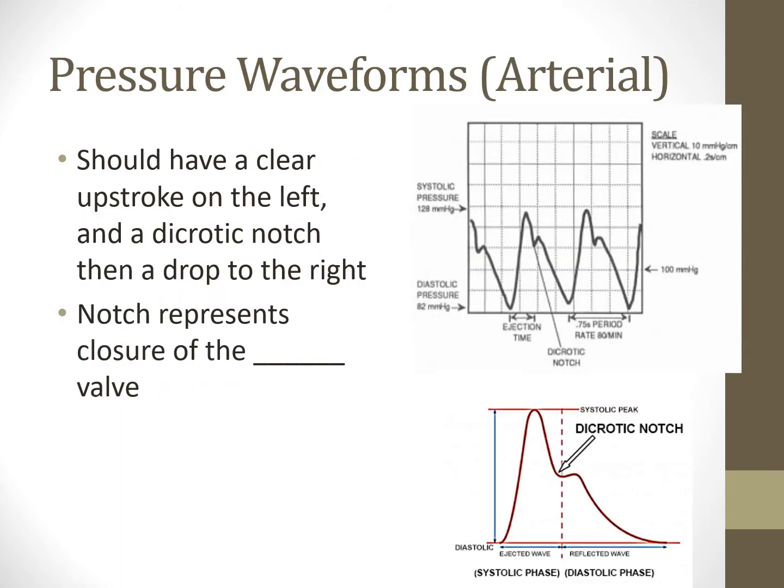So pressure waveforms, we're going to talk a little bit about the waveforms here, and you do need to look at these. I will test you on them. You should have a clear upstroke on the left and dicrotic notch drop on the right. The dicrotic notch here is marked out in these pictures.